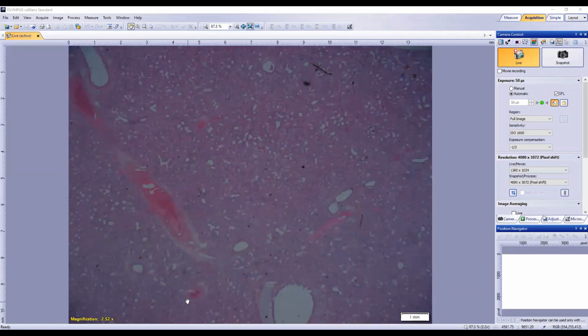Yeah, exactly. The reason that I'm focusing on this a little bit is that this description for an abscess or a granuloma or a nodule, say if we've got granulomatous inflammation with epithelioid macrophages or something like that, this kind of something in the middle surrounded by something else surrounded by something else is one of our canned descriptions.